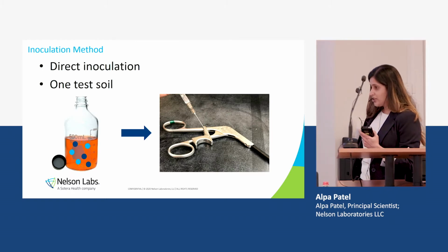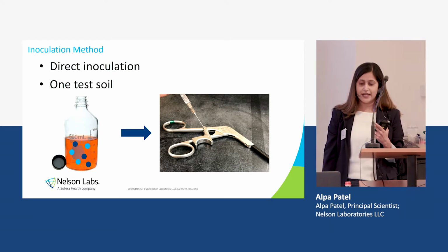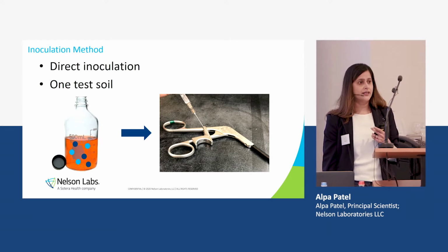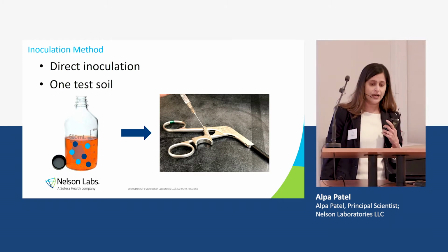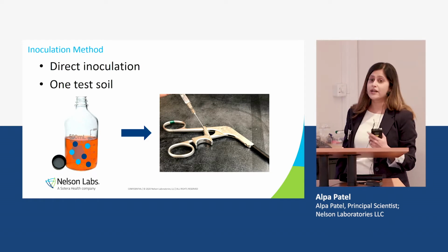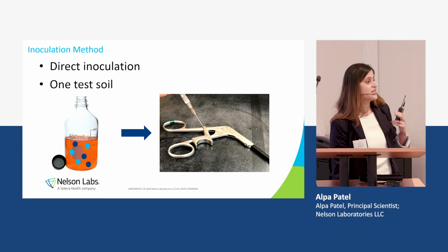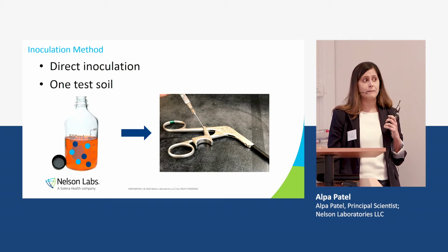Like cleaning validations, we have to contaminate the devices with bacteria, and we do test in a mixed suspension, except for high-level disinfection, and we inoculate in areas that are most difficult to sterilize. So we're just placing droplets of inoculum in areas that we think will be most difficult to sterilize. So it is a direct inoculation method.